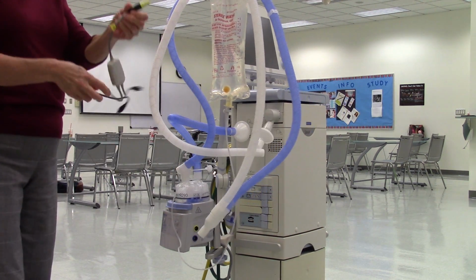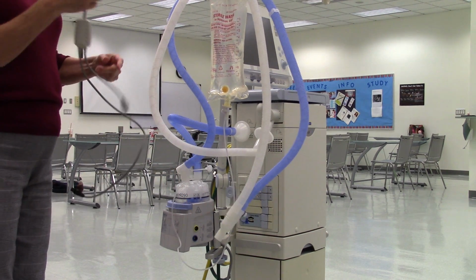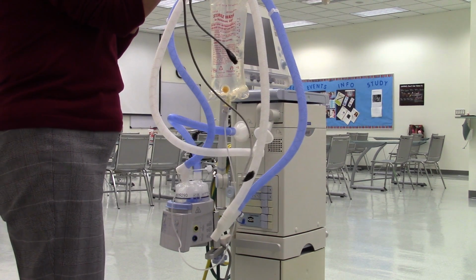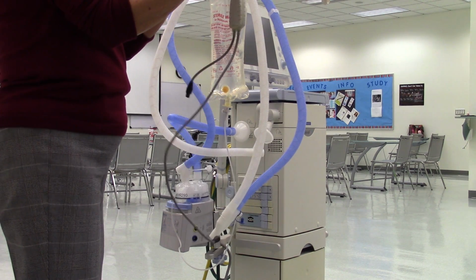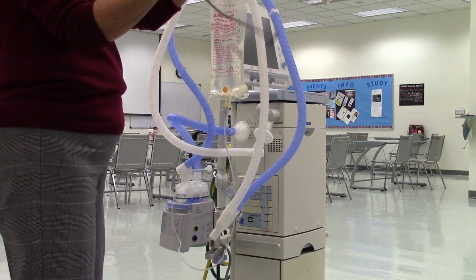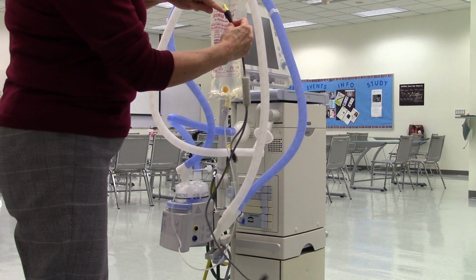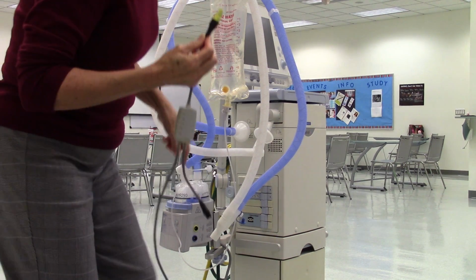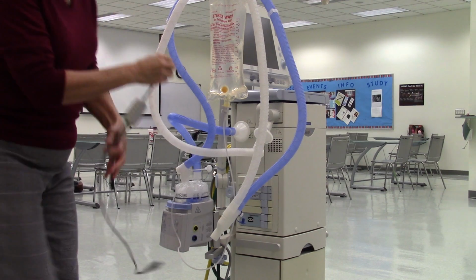All right, so I have the yellow connector, and I'm going to connect it to where the yellow ring is. But inside of this cable are some thin wires that stick straight out. So I can't do any twisting when I connect it, otherwise it busts those wires, and it's $250 to replace this. So we want to go straight in. So you look for this little yellow arrow. If you look really close, you can see an arrow. And you have to line it up to this arrow, and then push straight in.